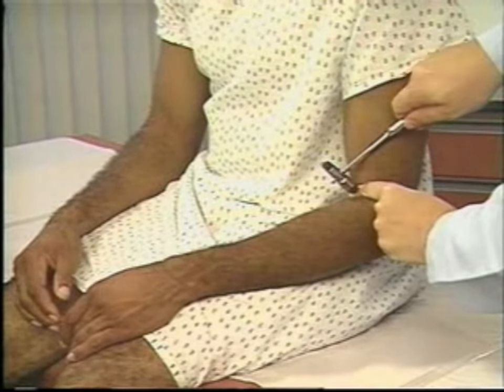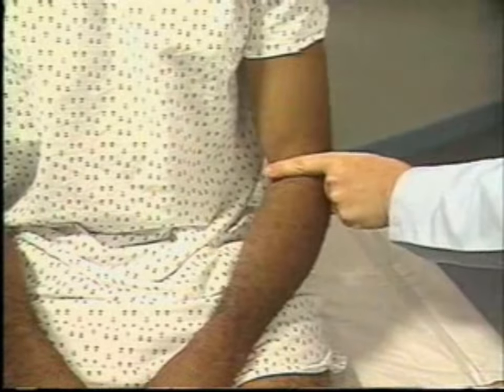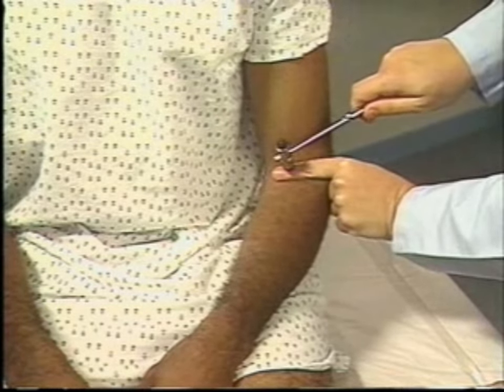Strike your thumb or finger briskly with the reflex hammer. You should feel the biceps muscle contract and see flexion of the forearm. Here you see a 2 plus response.